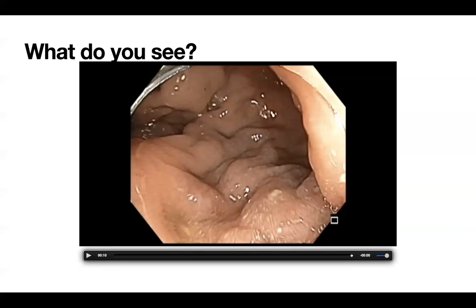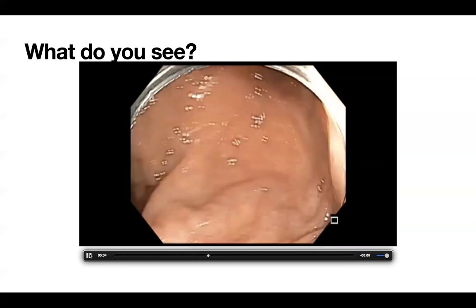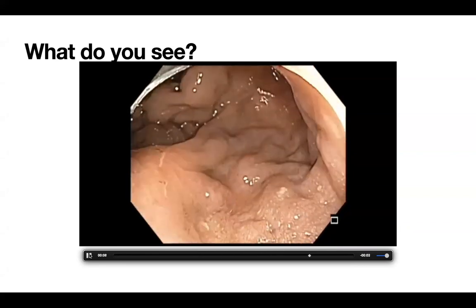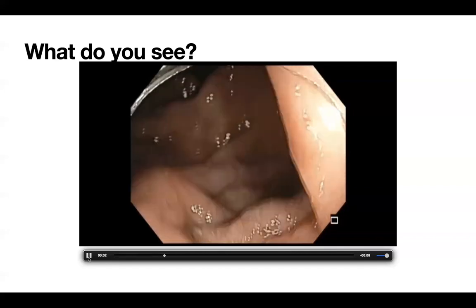It's difficult for me to appreciate the polyp from the hemorrhoids. Right. I think it's just here in the beginning of the video. I just saw the nodularity that is extending maybe proximally. Right. I think I should have actually given you a little bit of a longer segment. I'm sorry about that.